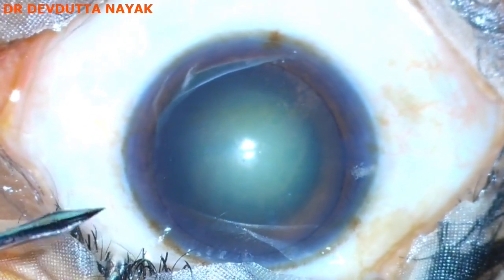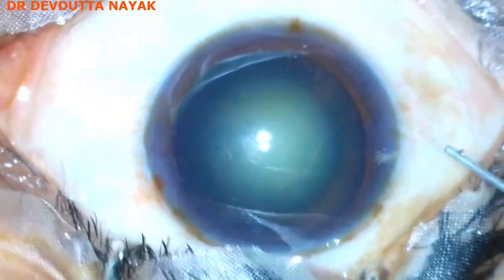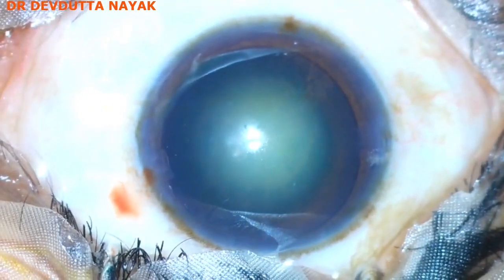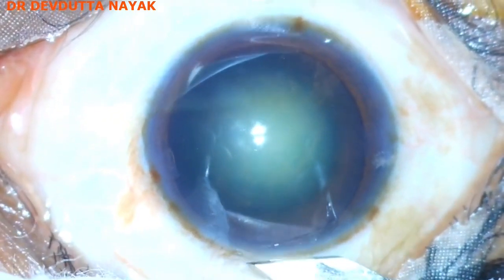We start off with making two side ports with an MVR blade, a little bit of intracameral lignocaine to supplement the topical anesthesia. The main port is being made with a 2.8 millimeter keratome.